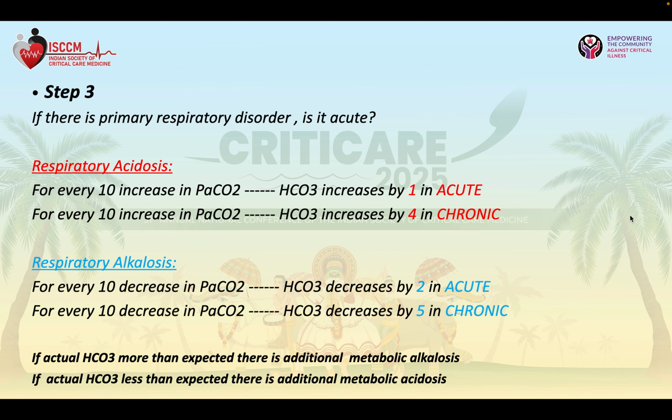Just to brush up, we started with the validation. We discussed the steps of validation. Number 2, we had that understanding of the clinical context, which is so very important to analyze ABG. Then we had a flow chart of the approach to the hypoxia on ABG, and then how to know which is the primary disorder.